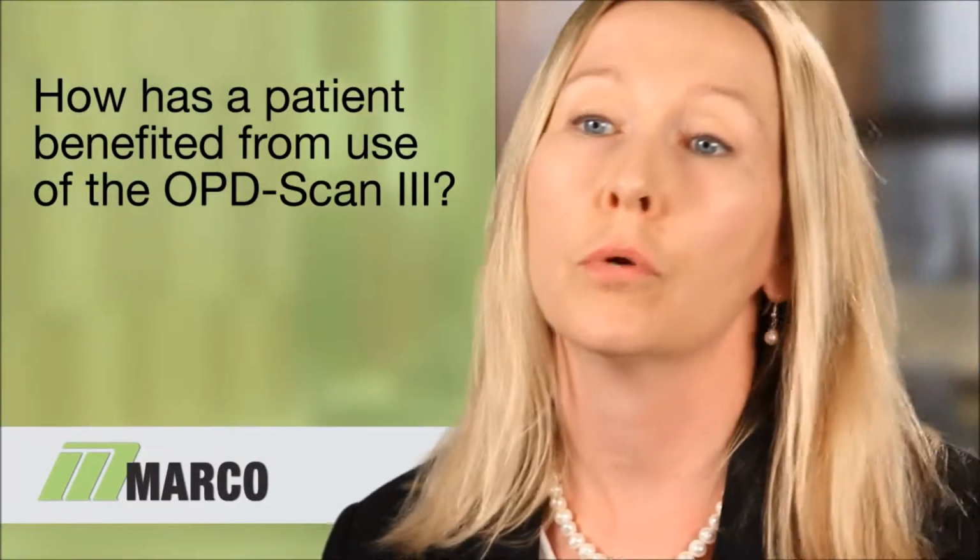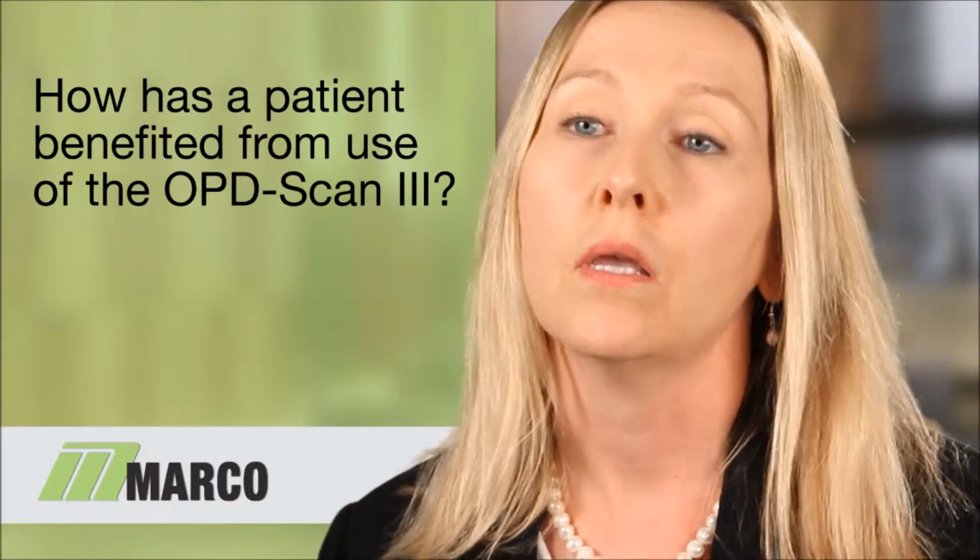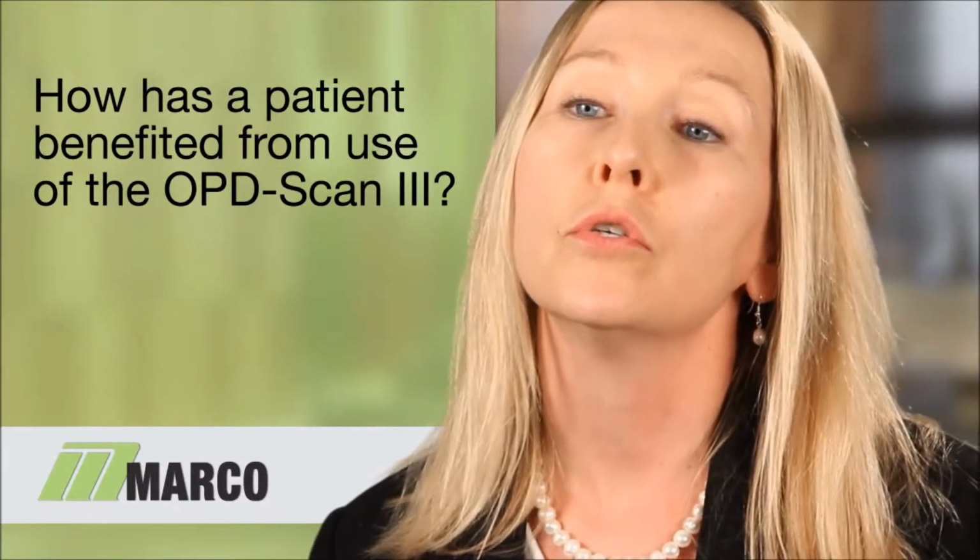In a few weeks, those aberrations increased, and indeed we then knew that the aberrations were coming from the posterior capsular fibrosis and not from the lens. And we were able to reassure the patient and explain to him that with a simple laser procedure, we will be able to help him improve his visual outcome and he does not need to worry about possibly explanting the implant.